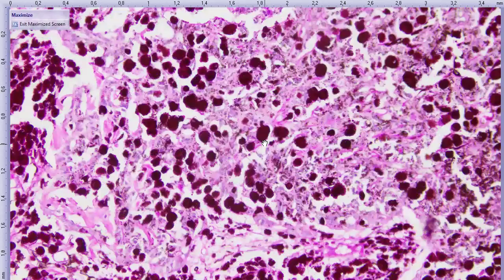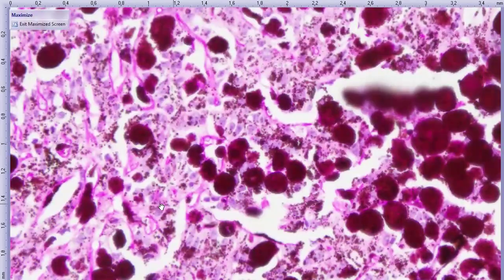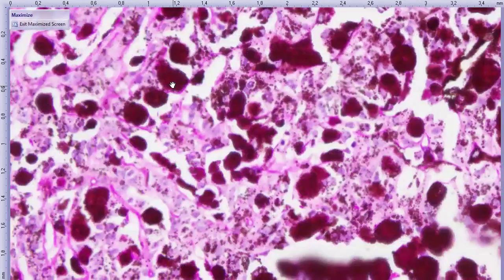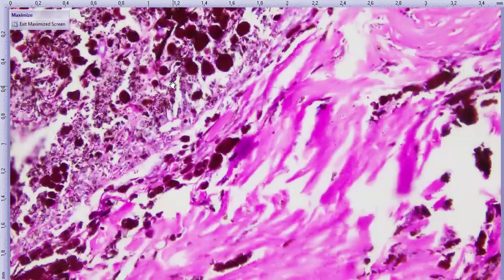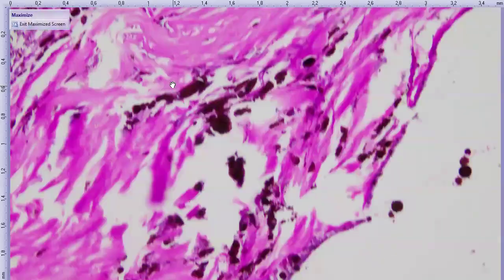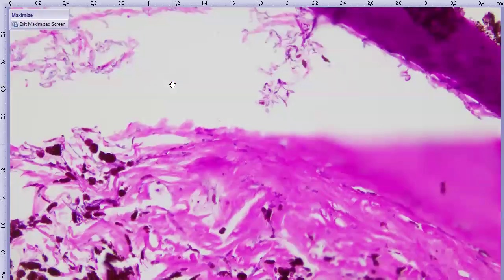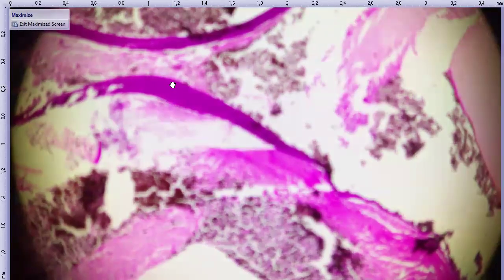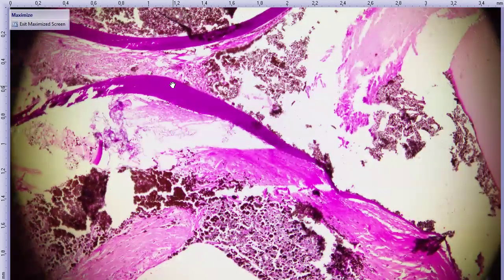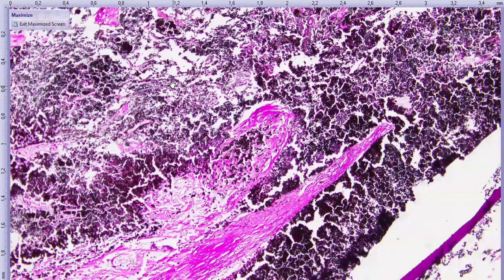Let's go back to an area where it's less pigmented so you can see. Here we go. So you can see basement membranes spread all over. They're not as thick as the main ones, but then you have areas like this where there's necrosis and some of the collapsed material maybe surrounding it. I don't know if that's the area that the person wanted to focus on, but does that satisfy? If there's anything else you wanted to show, you could speak up.